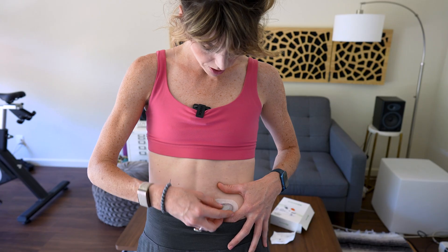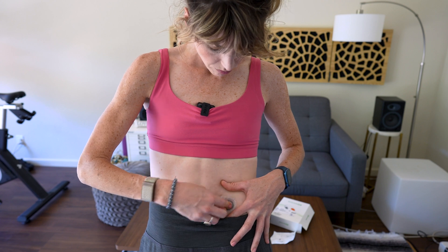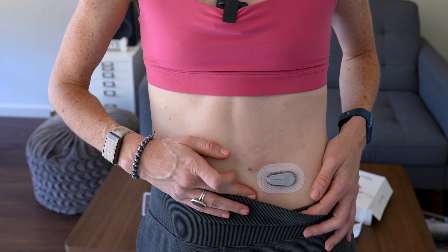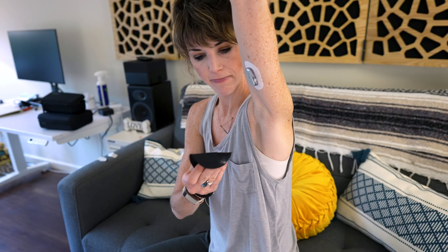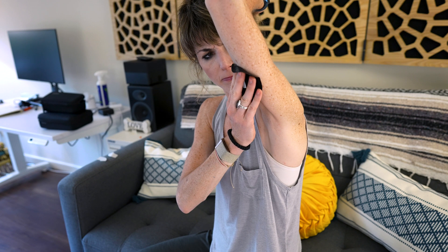But before we get there, let's quickly go over just a couple more things that you might want to know about the Dexcom before getting started. Let's talk stomach versus arm. I personally found it kind of uncomfortable to wear the Dexcom on my stomach — it got in the way of my pants, especially those compression pants, do not recommend. And it just didn't really feel great doing any type of ab workouts like crunches. So for me, I prefer the arm, although it's much less discreet since it does take up a lot of real estate.